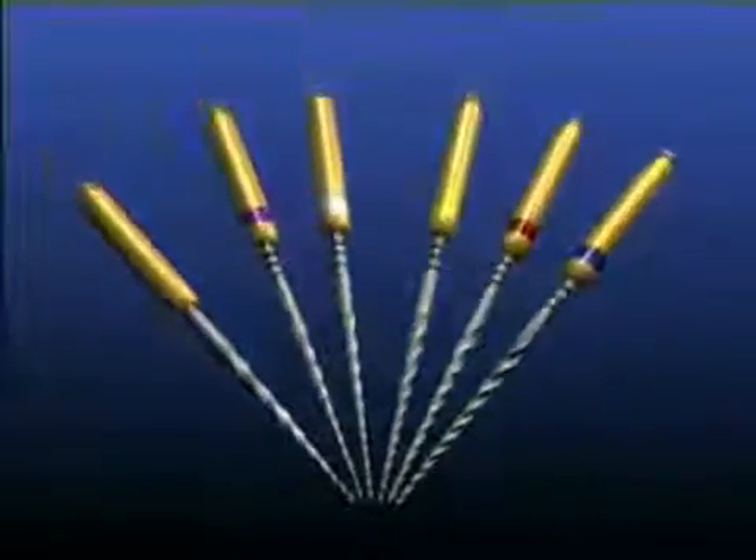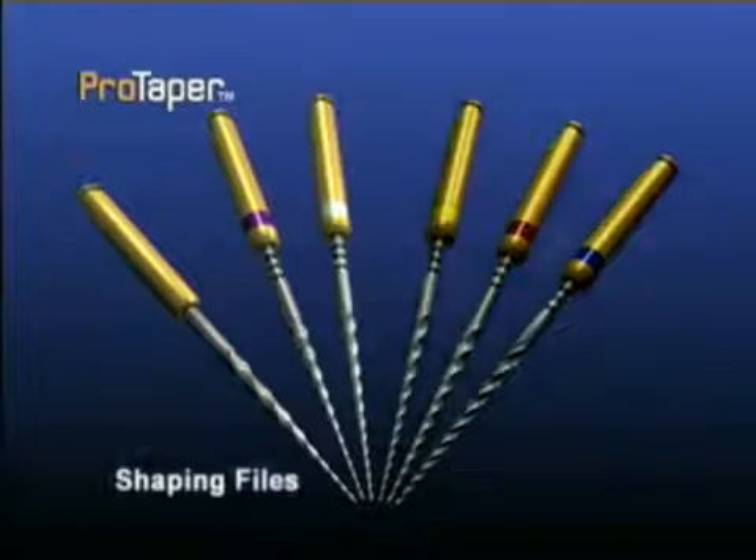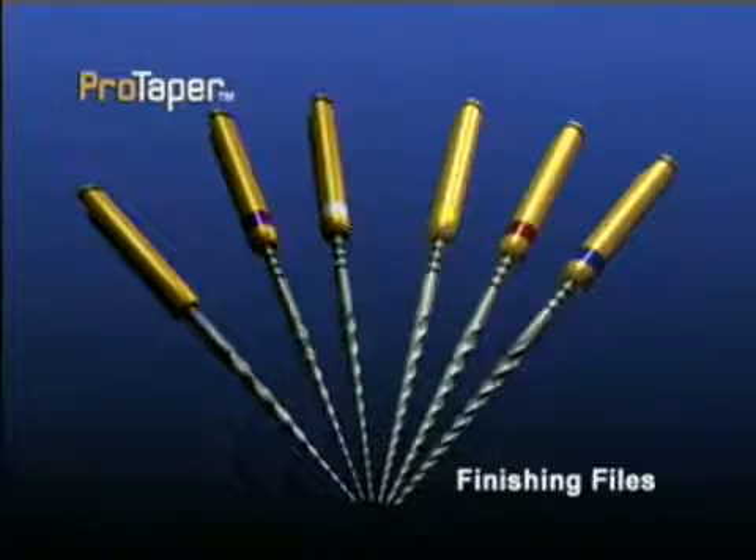The new ProTaper instruments represent a revolutionary progression in root canal preparation procedures. The basic series is comprised of three shaping and three finishing instruments.